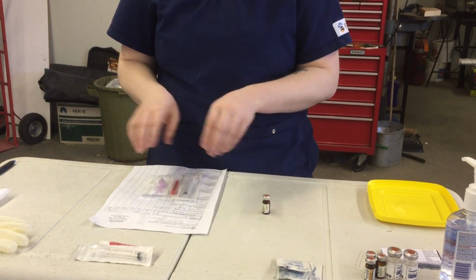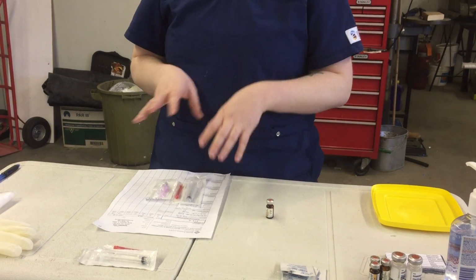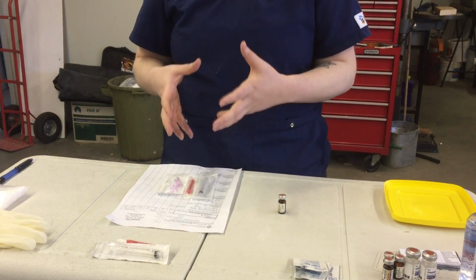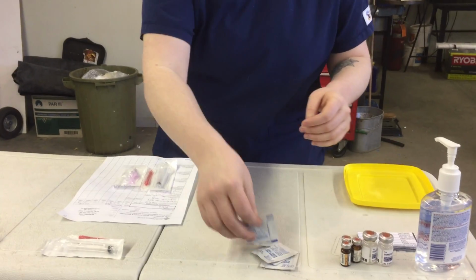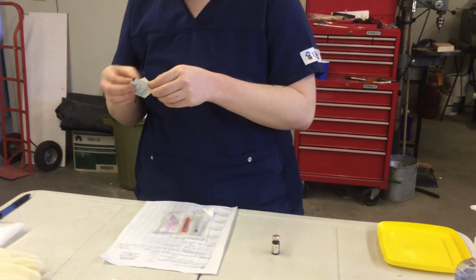So once I've done that, I would just check the integrity of these packaging. Obviously for demo purposes, these have already been opened, but in a clinical setting, they would be new packages for these items. So after I've done that, I'm just going to wash my hands. I'm going to open a new alcohol swab. This can go in the garbage.